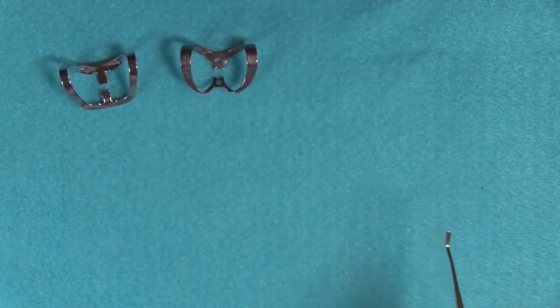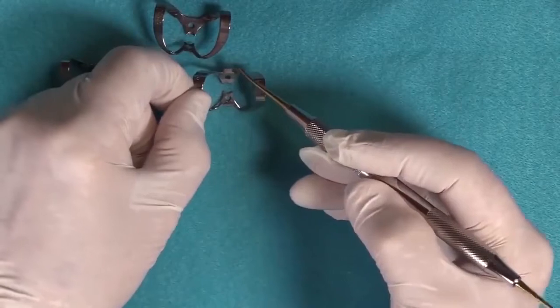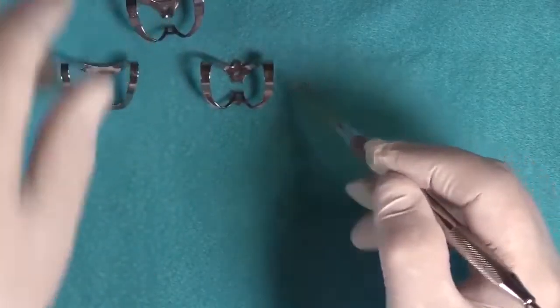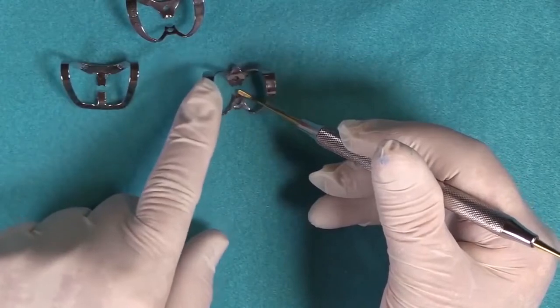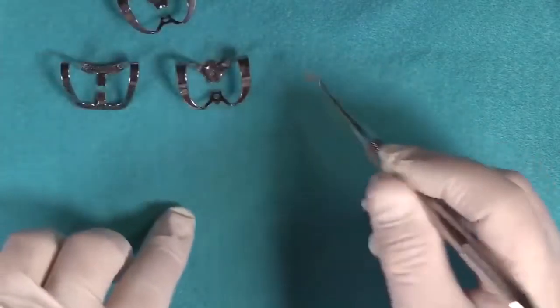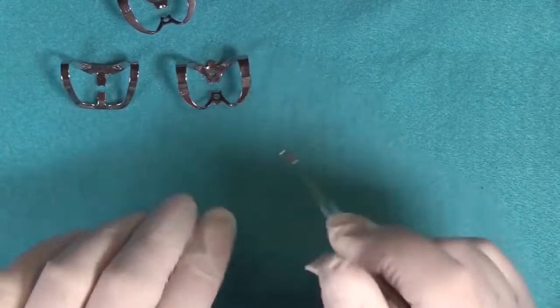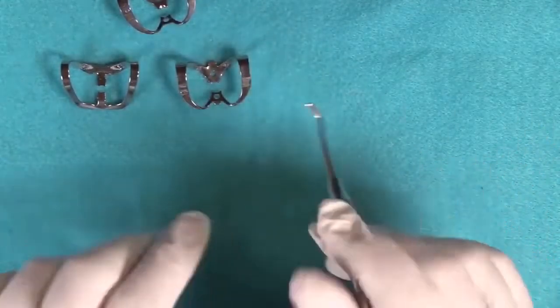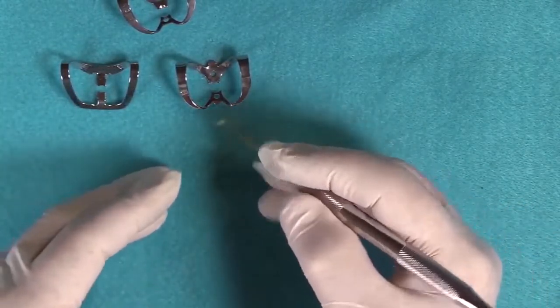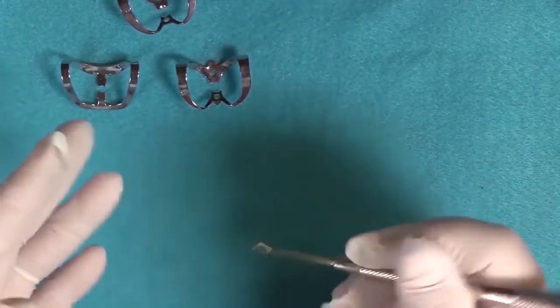But the winged number 9, see the difference? They have tiny, tiny little wings. They're really small. See how small they are? And if you're using a non-latex dam with the number 9 winged clamp, normally if you say number 9, that means winged, you need to punch the hole size a little bit smaller, because it'll stretch. The non-latex dam has a more slippery surface, so the wings won't stay in. So I usually go with a number 3 hole.